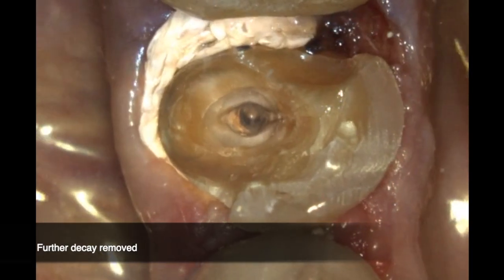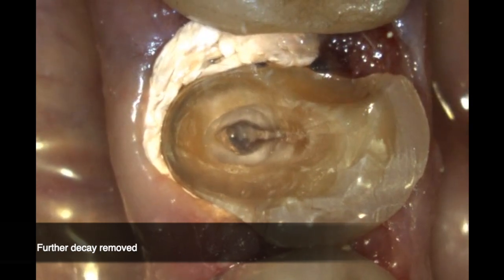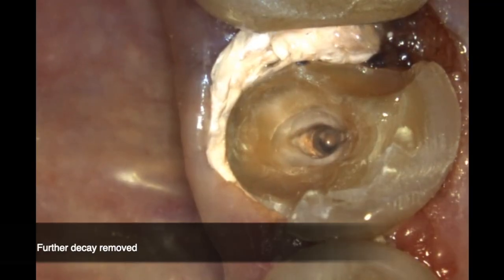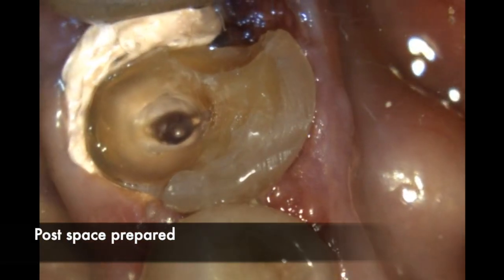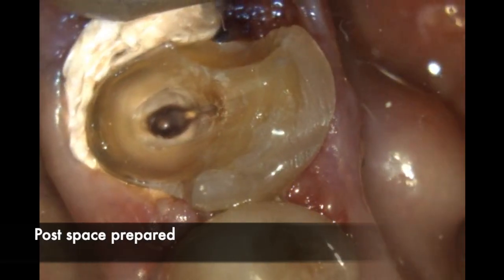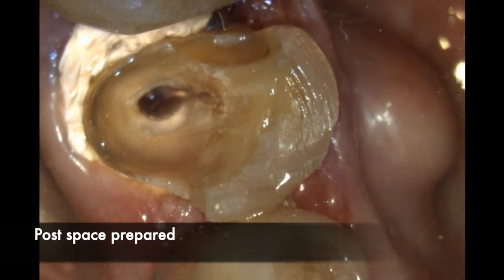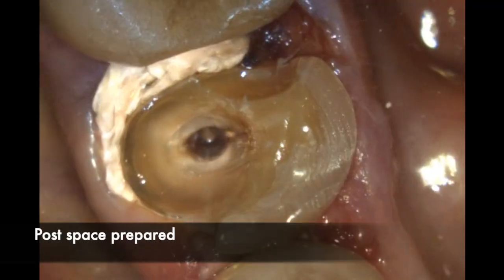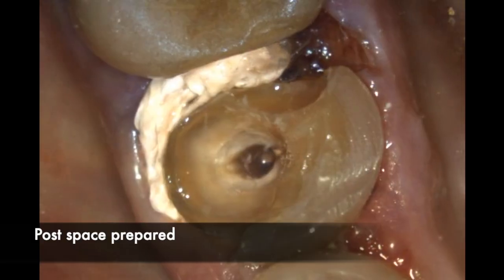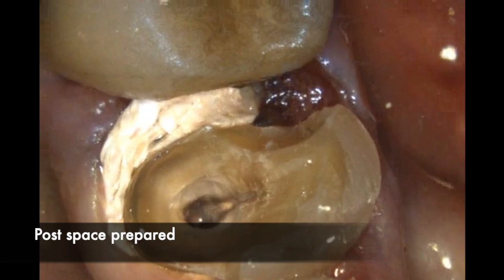The next step was to access the pulp chamber by removing the root canal sealer. I cleaned up some more weak tooth structure just to ensure the area was completely decay free. Next, create the post space with whichever system you're using. Ensure the post you select is of the same size as the canal, go deep enough into the canal to retain your buildup, and choose the right post depending on the situation.